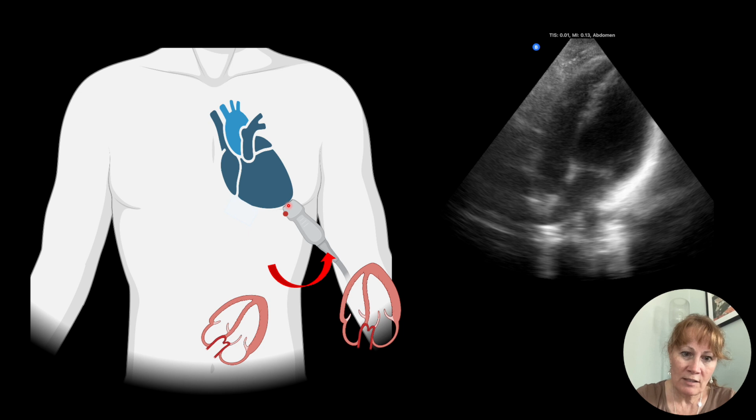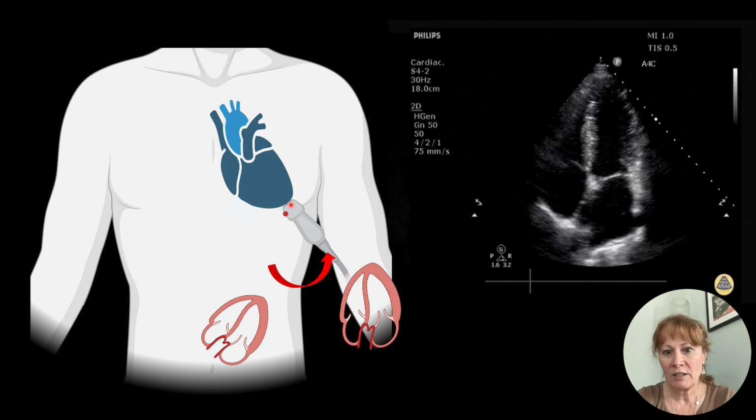And that way you can see that the interventricular septum, which is right here, will be straight up and down. So it will look like that. So that's how you correct that. And that's how you know it's definitely an apical 4 and not somewhere in between an apical 4 and a subxiphoid view. But really, really nice job with your images.